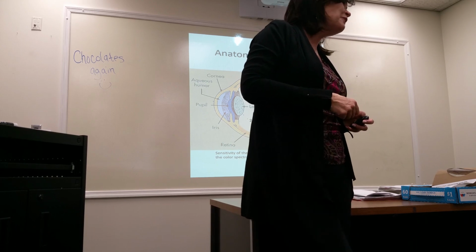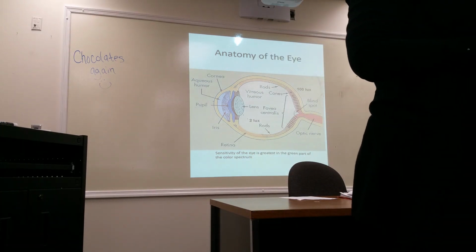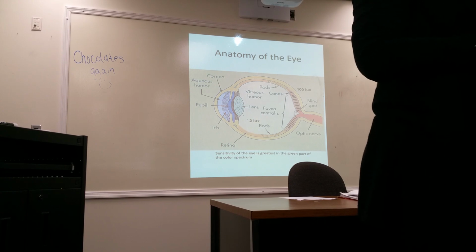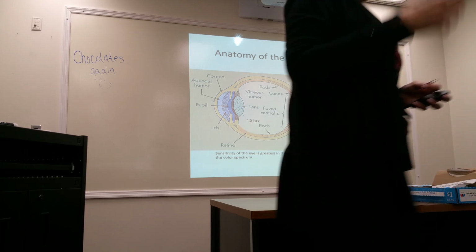So now that you're in the field, do you think a radiologist is going to walk into the room and everyone's going to hang out for 10 minutes while their eyes dark adapt? That's a year in radiology time, right? It's just not going to happen. So they would wear those red goggles.